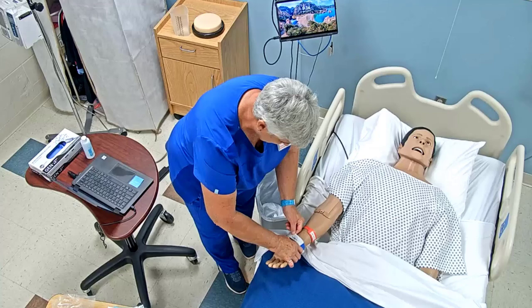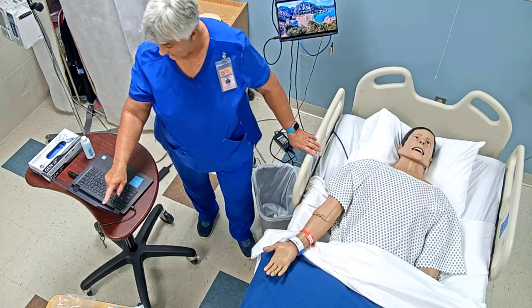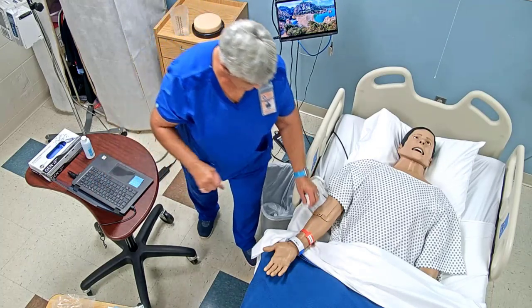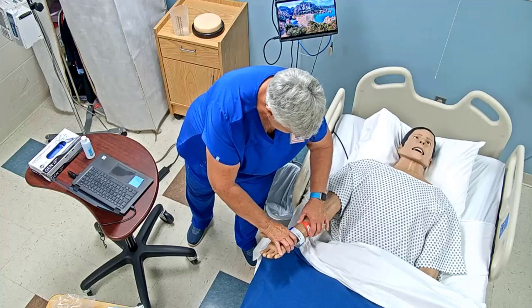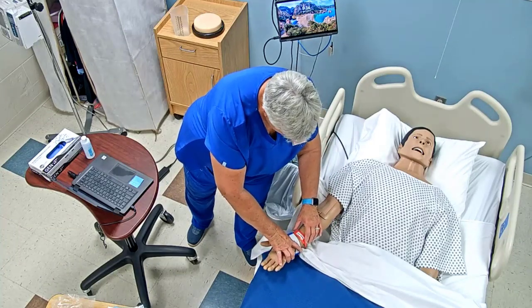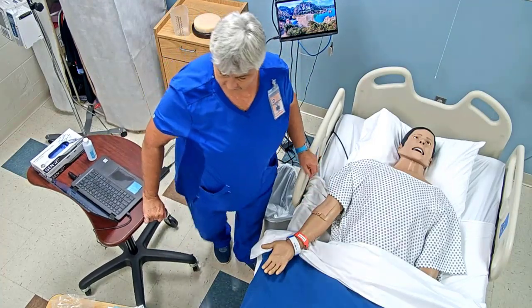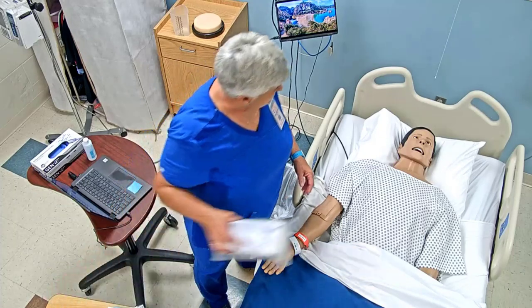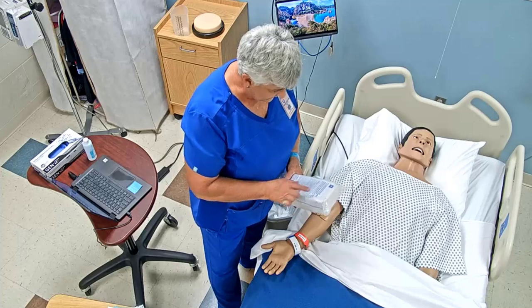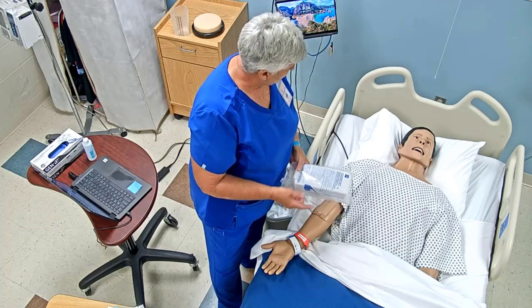Okay, let's start that over. Brad Taylor, 4/24/1991. Okay, I've got Brad Taylor, date of birth 4/24/1991. Now, Mr. Taylor, are you allergic to any kind of medications? No, you don't have any allergies to any medications. Okay. Do you have any allergies to any cleaning antiseptics or anything like that? Our kit has iodine in here for cleaning, or betadine.